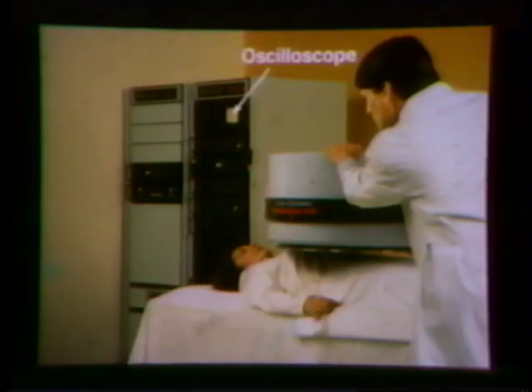The X and Y positional pulses are used to position an electron beam in an imaging oscilloscope, which then produces a dot on the recording film corresponding to where the photon struck the crystal. Since the collimator eliminates non-perpendicular photons, the location where the photon struck the crystal is directly related to the location of the molecule of the radiopharmaceutical within the patient's body.